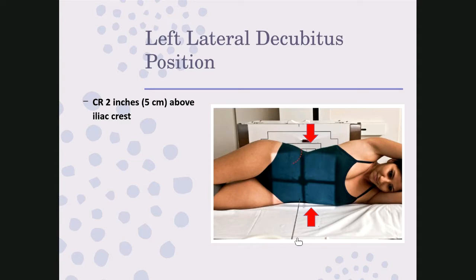It'll just fall forward. When we did the supine abdomen, the tissue tended to fall to the side and make the patient thinner. This isn't going to make the patient thinner. It's just that all the abdominal tissue will fall forward. So we need a little more quantity of photons to get through that patient. So 80 at 12.5 would be a good baseline technique.